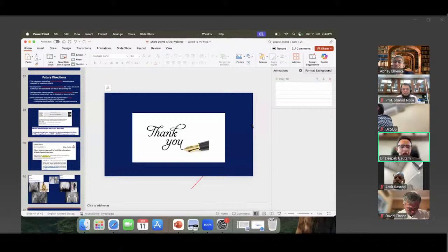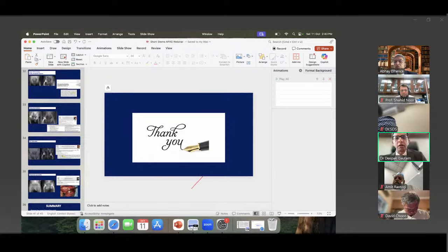Yes, sir. Medial perforation, yes, I had a couple of times, but the best part is, even if you have medial perforation, you can readjust it. And if you have a good fixation primarily, you can go along with it. Lateral perforation, once I had it, it was missed during the surgery. In the post-operative period, I saw it on the X-ray; it had been missed during the primary surgery. I kept it and followed up. The patient did well after 2 years, and after that he was lost to follow-up because I shifted to Mumbai. I did not have to revise that one. In 3 cases, we had to revise to the standard stem. It was in the initial learning phase of the short stem, not in the later phase, sir.